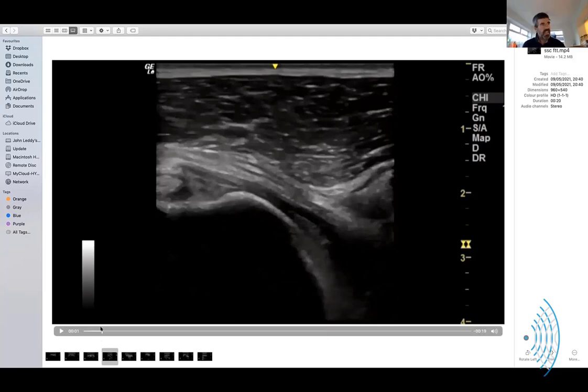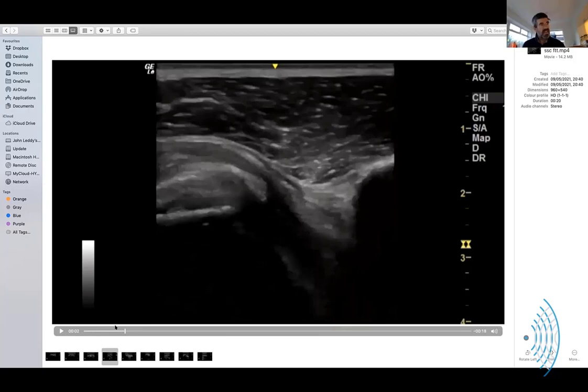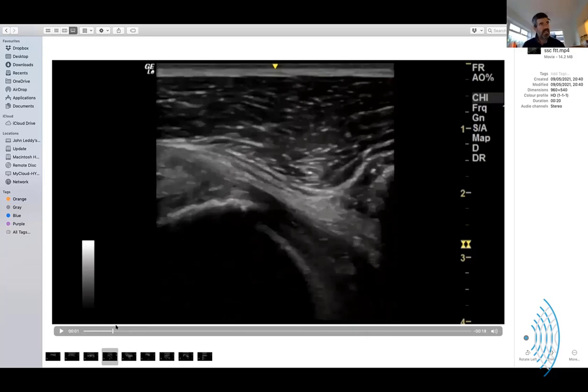And it's just a bit too, it's gone off the top. The top part of supraspinatus is not there. Subscapularis or supraspinatus? Through subscapularis. Yeah, okay. It's coming there. Just that little biceps is coming out of the outer thing there, but we would still expect there to be a little bit of subscapularis there. And you can get that there when you're looking.